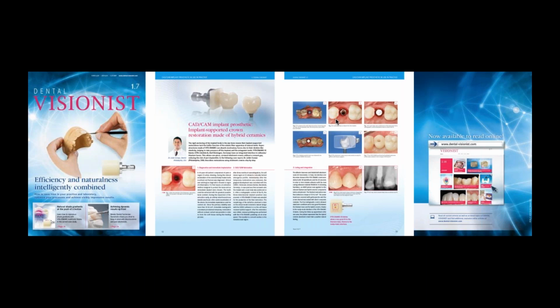And then I always like to try it in first as a cement retained restoration. Once I confirm that I have nice interproximal contact points, I will clean everything in the ultrasonic, and then I will start with the APC Concept to get the Ti-base ready, and etching and silanizing the Enamic restoration. Then we will do the extraoral cementation and deliver it as a screw retained restoration.